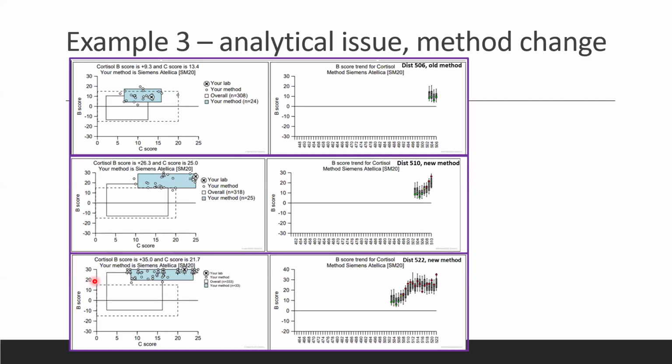used when we are trying to identify the cases of cortisol overproduction or Cushing disease. So I guess in these cases, it's very important to inform the endocrine team who is receiving these results and interpreting these results, keeping them informed about the method, about the bias, and in some cases, a different temporary reference range can be adopted to take into account a positive bias such as this one.